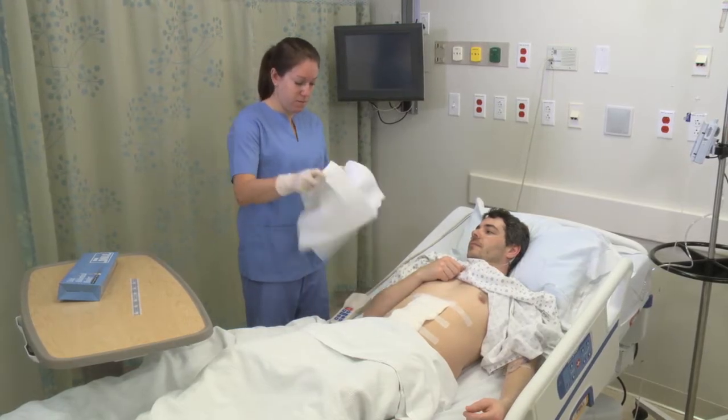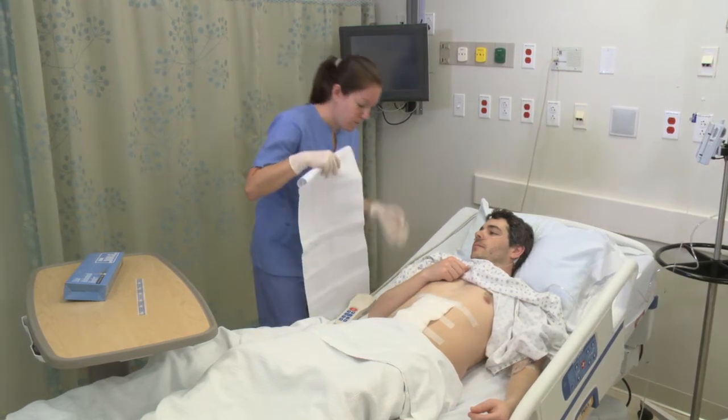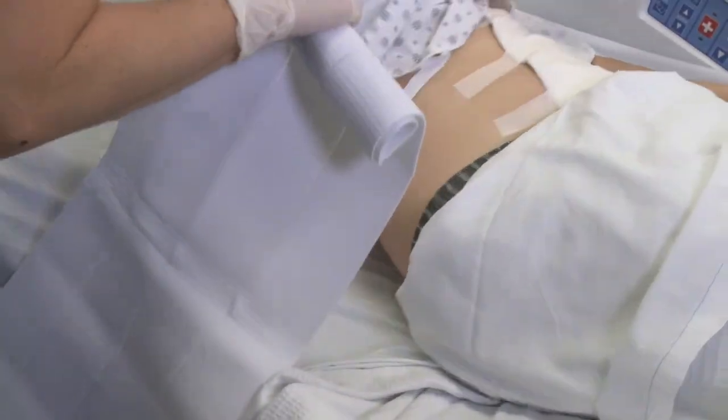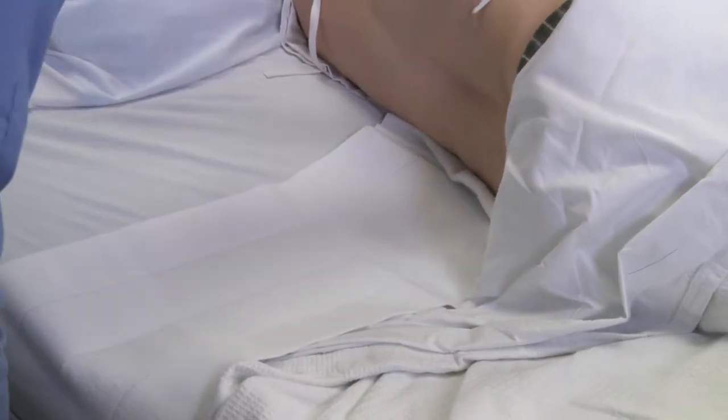Position the binder with the soft lining against the skin, the hook fastener on the patient's right, and the seam at the center of the patient's back. Make sure that the lower edge crosses halfway down the buttocks and is low on the patient's pelvic area.